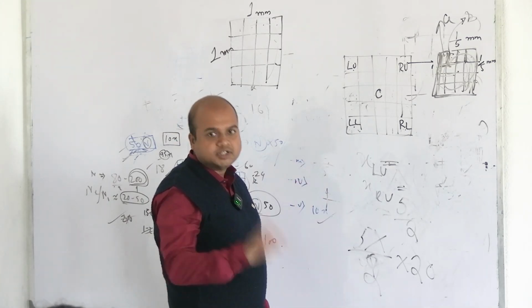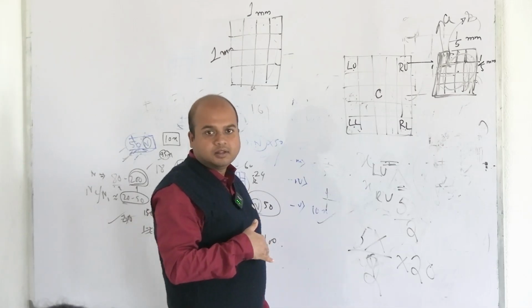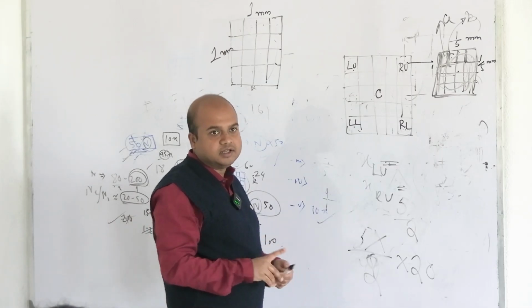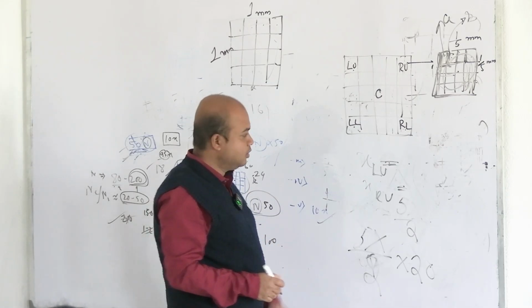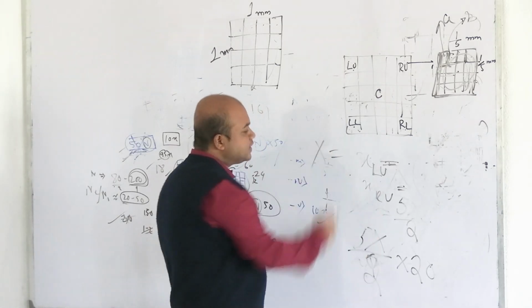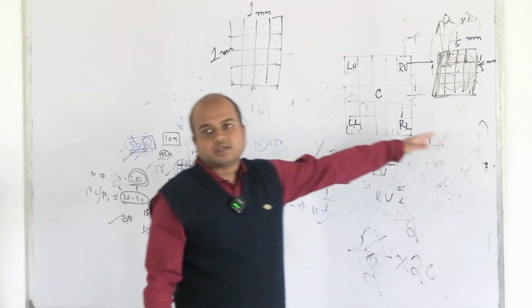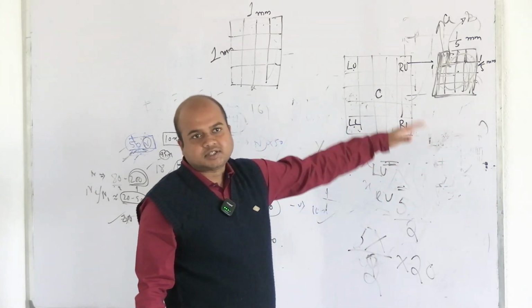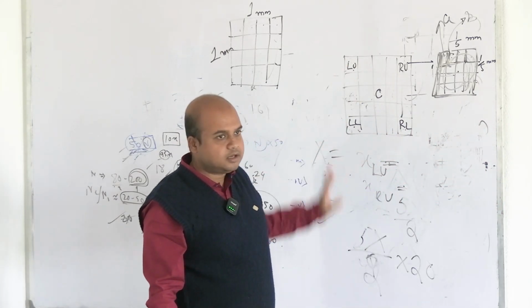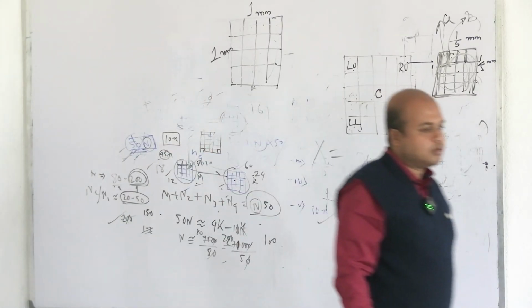But for considering uniform distribution, I have counted the corner ones and the central ones, so that is the reason for counting the central one. So there will be 5 figures. The capital X, or the whole number of cells counted, is x equal to x1 plus x2, or x left upper, x right lower, up to the 5 squares. That is the total number of cells counted.